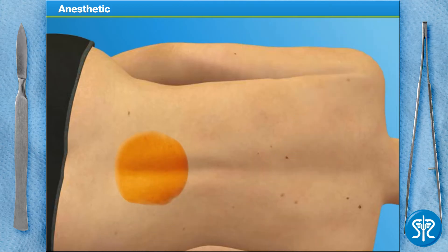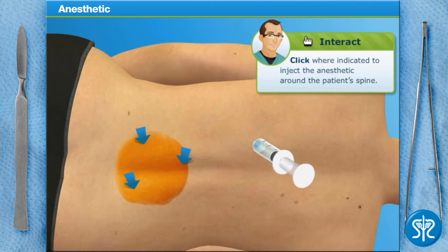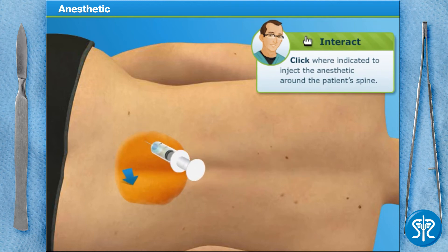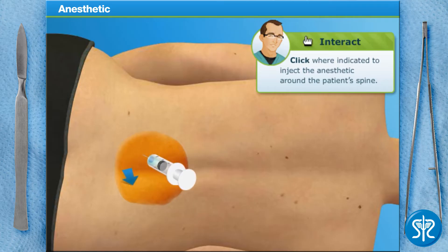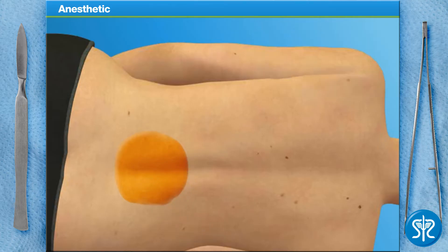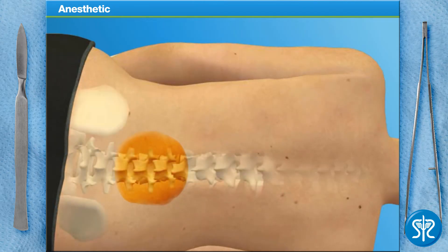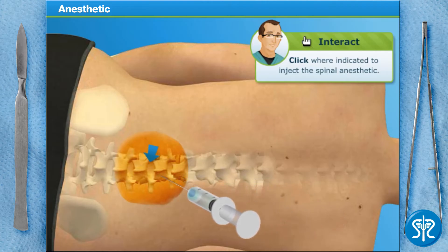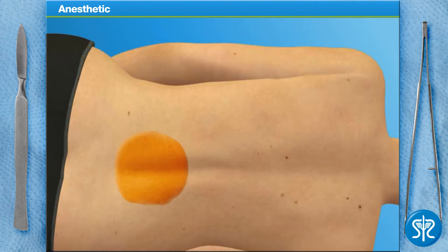Next, we'll inject a local anesthetic to decrease the pain the patient will feel when we inject the spinal anesthetic. So far so good. Now we need to inject the spinal anesthetic directly into the patient's spine. Now just place a bandage over the injection site and we'll move on.